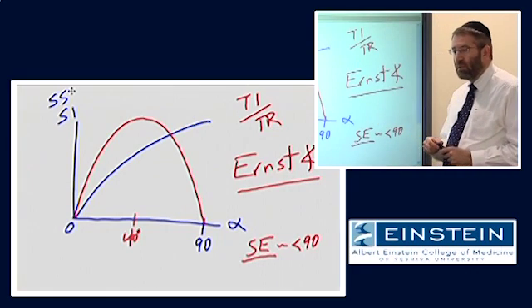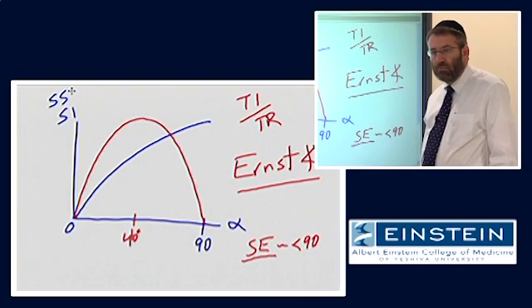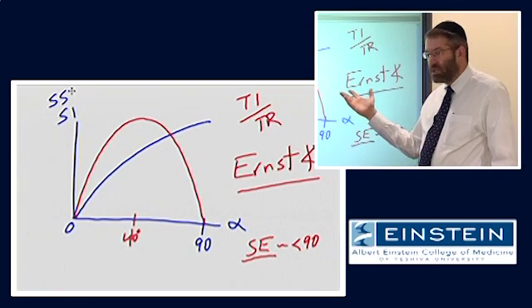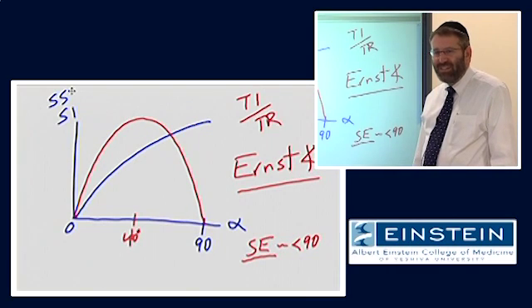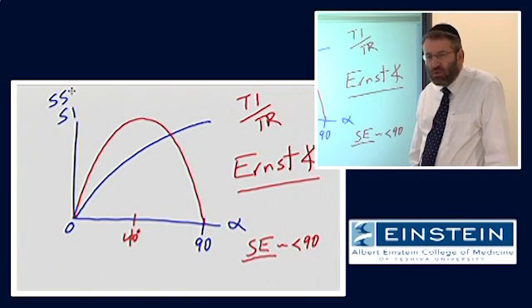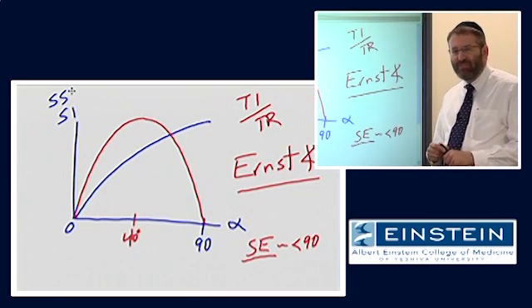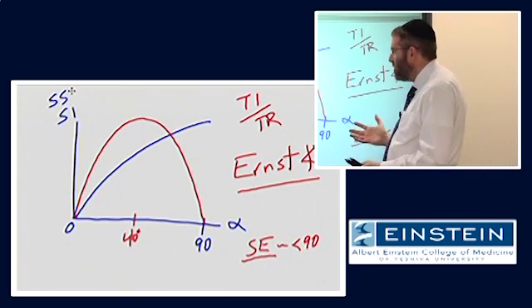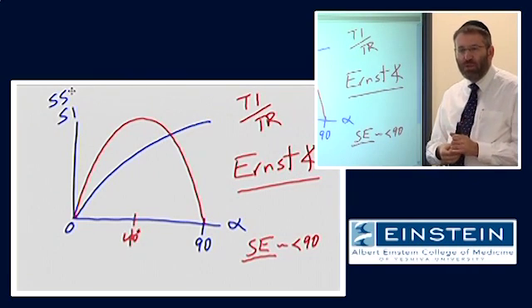Question? No? Okay. Question? Yes. When you talk about the T1 of that tissue, how can you talk about that in a given slice? You're going to have vastly different tissues with different T1s. Okay, and different tissues technically will have different Ernst angles. That's life. So you're right. There's nothing you can do about that. But within a tissue, there's some range of T1, and we can do our best to choose an angle that is going to be optimal as a whole for whatever it is that you're imaging.